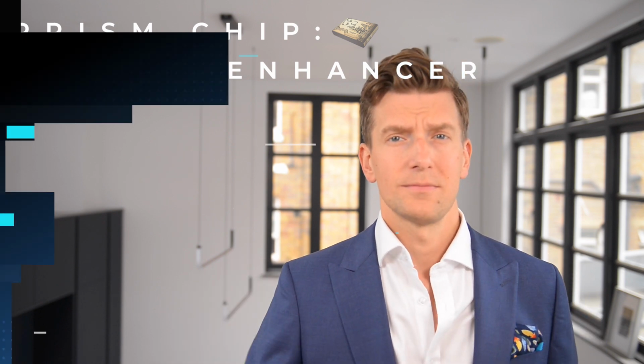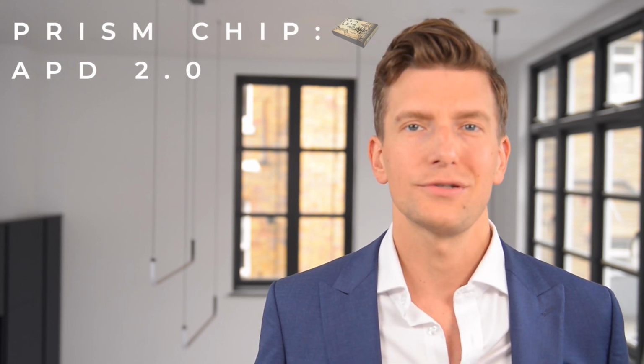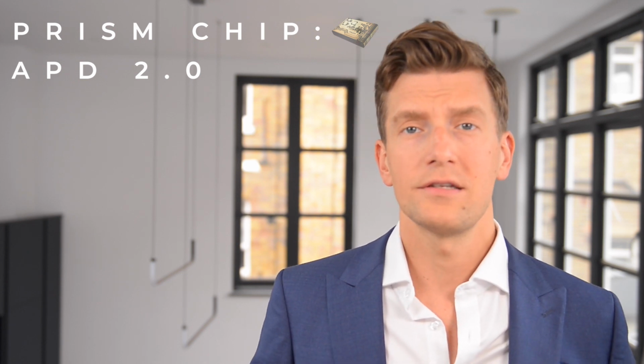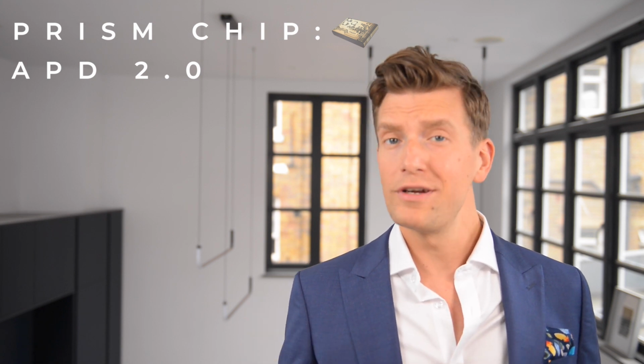APD 2.0 is Phonak's new and improved fitting formula, which I'm pleased to say they're boasting it's a lot closer to the traditional NAL-NL2 fitting formula that we consider the gold standard in terms of matching hearing aid settings to targets when we're performing real ear measurements.